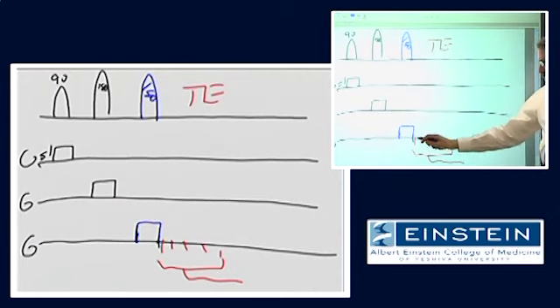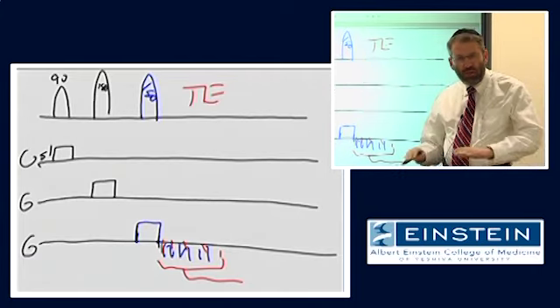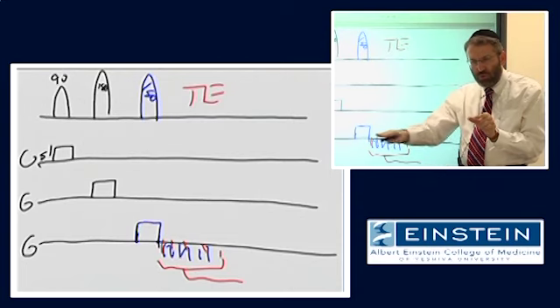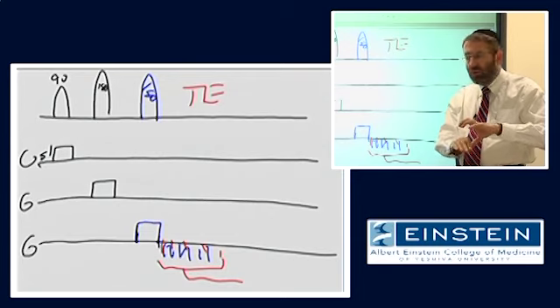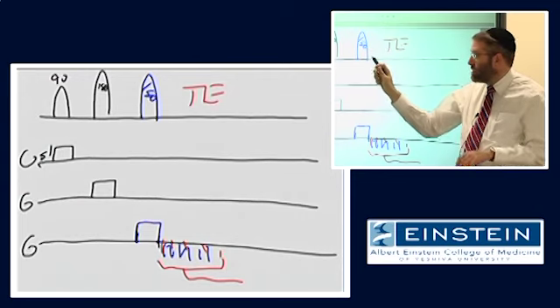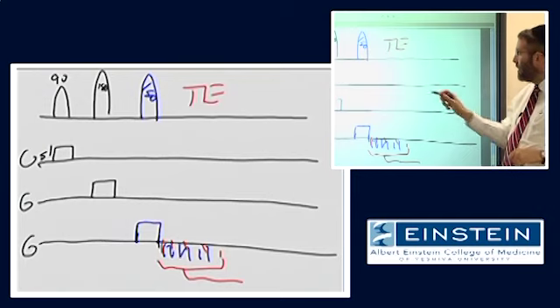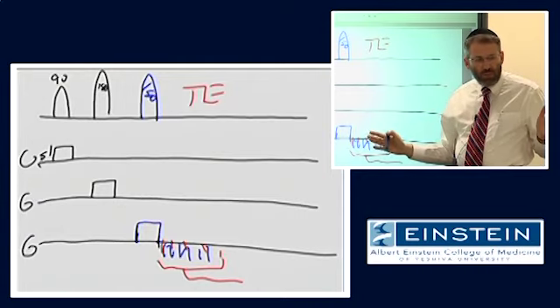Now, when we sample our signal at TE, this third RF was applied in the third plane, which intersects with the column of tissue perpendicularly. So there's now only a cube or a prism of tissue which has seen all three of these RF pulses. So we essentially have a multi-spin echo technique where only the spins within this one little prism of tissue are fully refocused at TE. The others have lost their signal with T2 star.